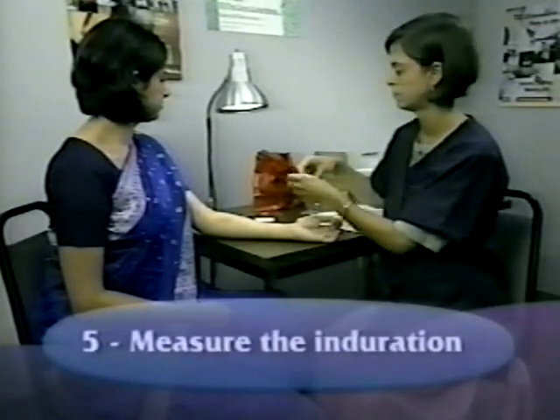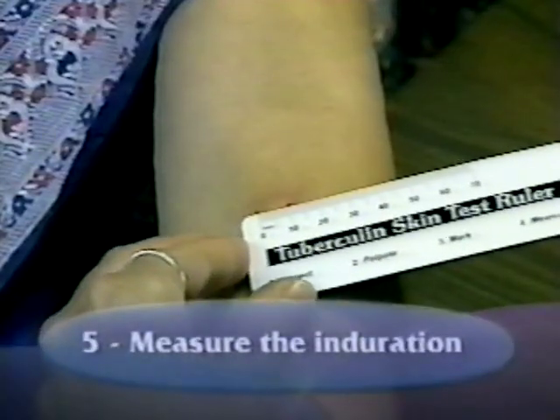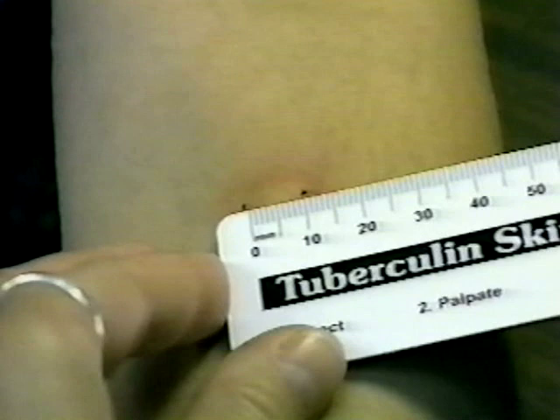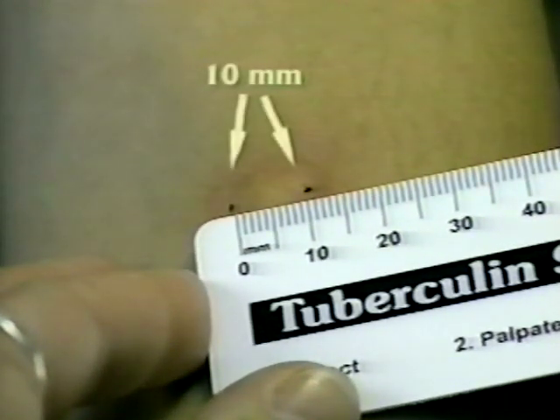To measure the diameter of the induration, use the millimeter ruler. Place the zero ruler line inside the left dot edge and read the ruler line inside the right dot edge. If the measurement falls between two divisions on the millimeter scale, record the lower mark. The induration shown here measures 10 millimeters.